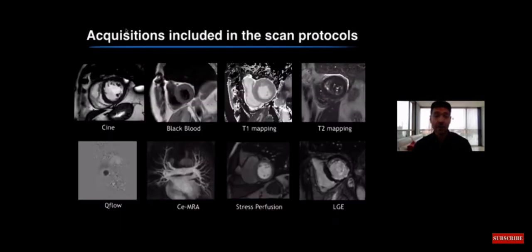So what about cardiac MRI? We currently carry out practically all the standard cardiological protocols available.